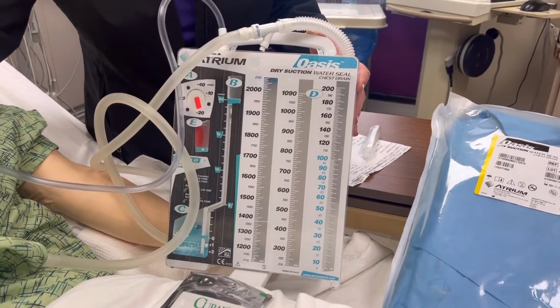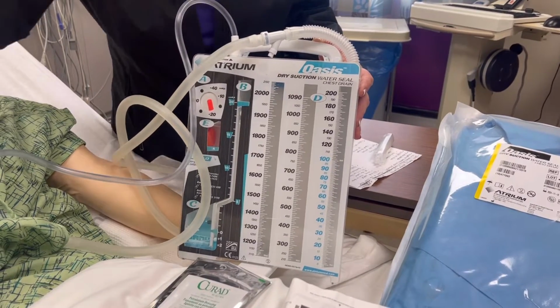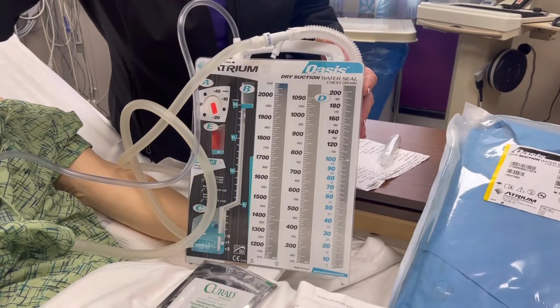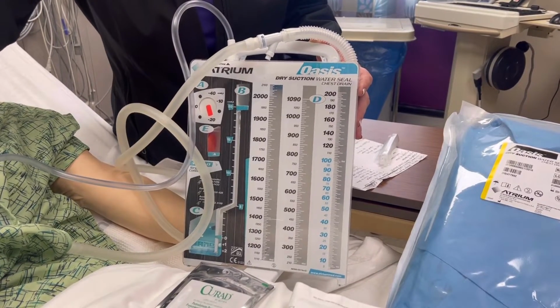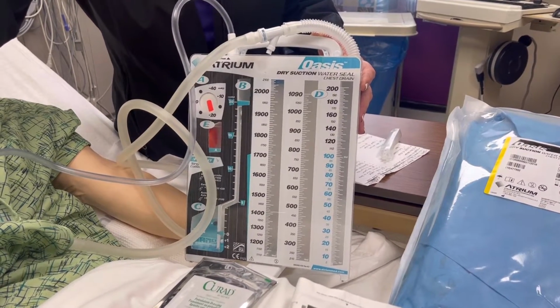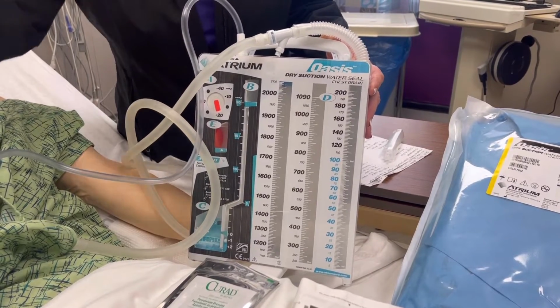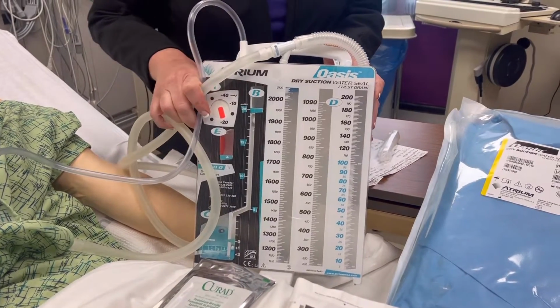Is there any signs of redness or infection? Those are the things that we're going to want to look at. We're going to document I&O in that in and out section, and it's never acceptable to just leave a blank entry. If there's no output for that current time period, you need to put a 0 so that it will calculate correctly.